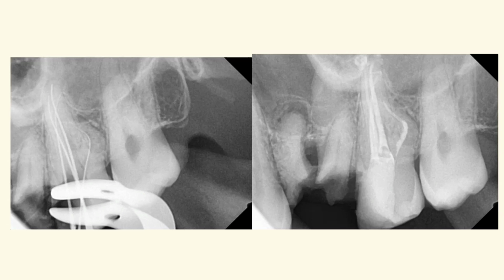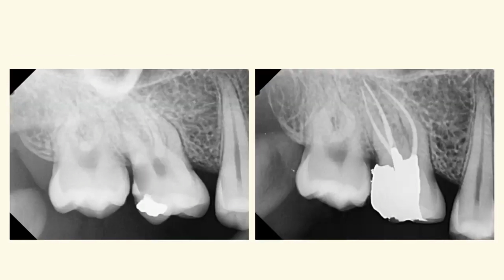Another case of acute curvature in the distobuccal root. Every step in endodontic treatment is important in order to achieve the desired end results. However, creating the correct glide path for the canal you are treating will make each of the following steps in your treatment protocol much easier to perform, resulting in cleaner, well-shaped canals that can be ideally obturated. So spend maximum time on the glide path preparation.